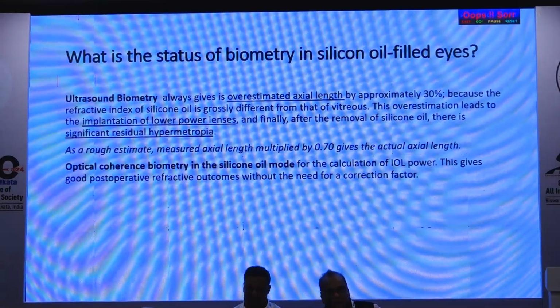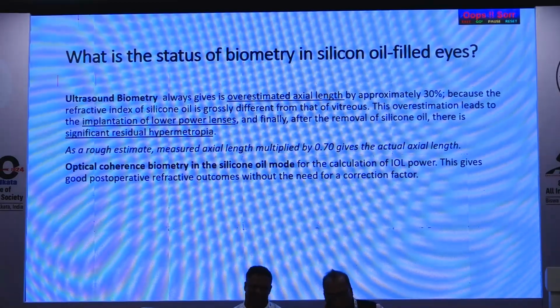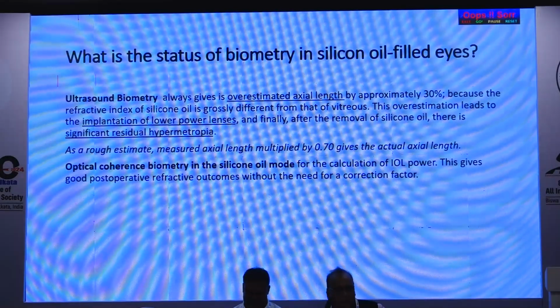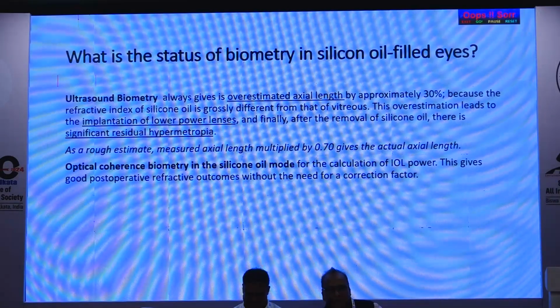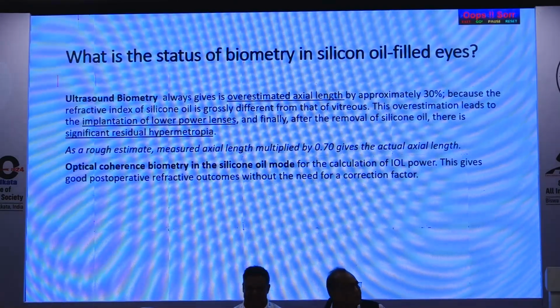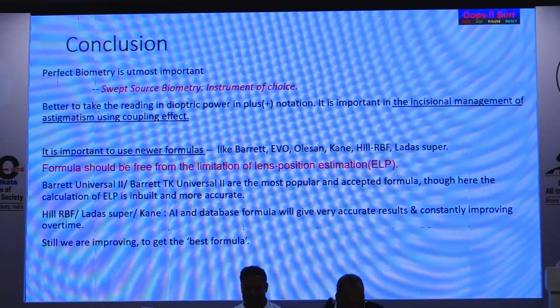When doing biometry in silicon oil filled eyes, here again we have an optical biometer where we can also get optical coherence biometry in the silicon oil mode, where we can get good results. So, in conclusion, perfect biometry is of utmost importance.